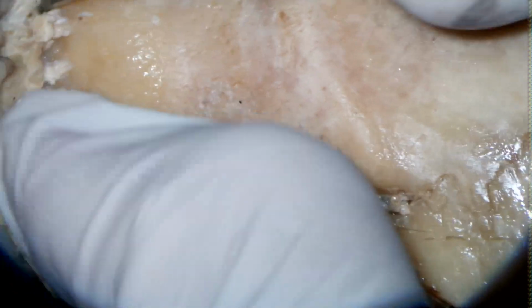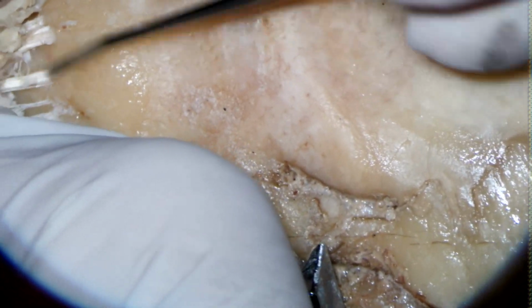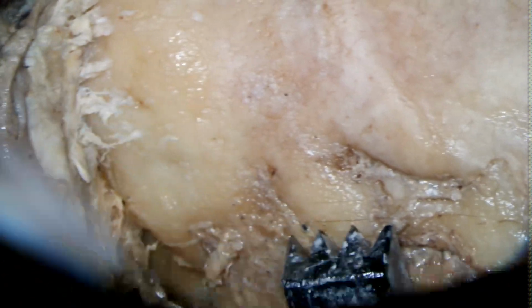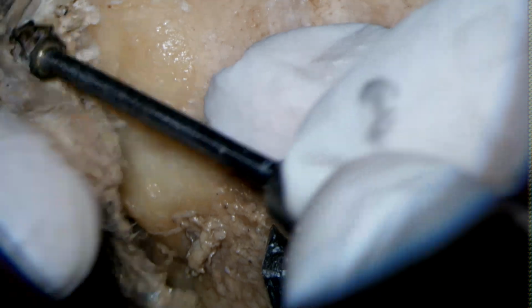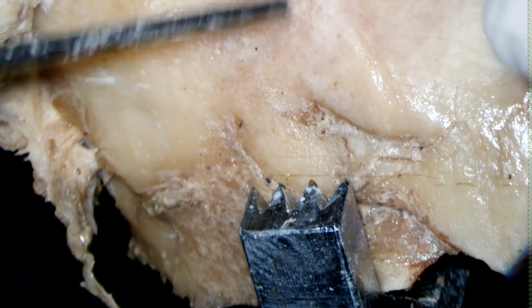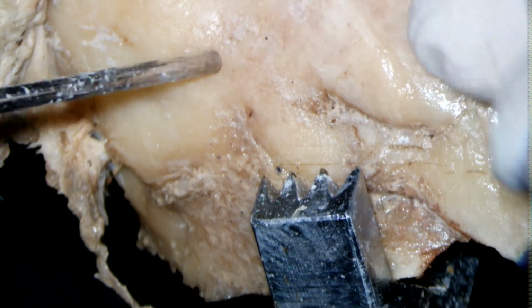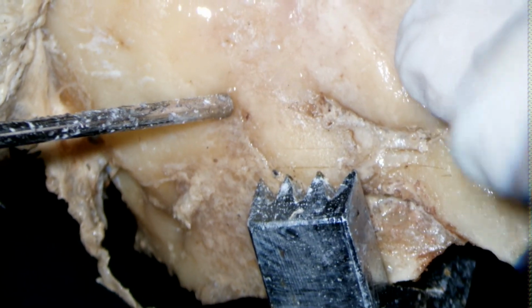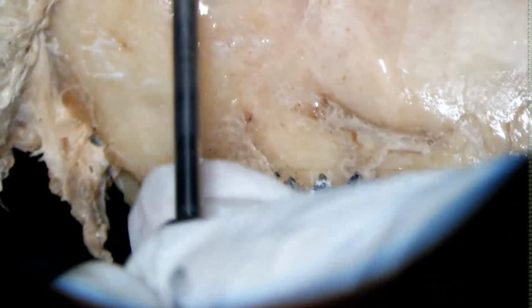Let's take the blade. I think the blades are fine. Anyway, let's start. Okay, so you expose the mastoid properly. Okay, knives. So we'll just mark the. Water.